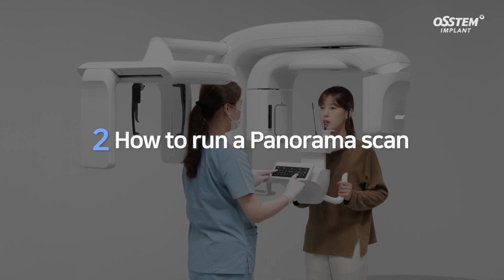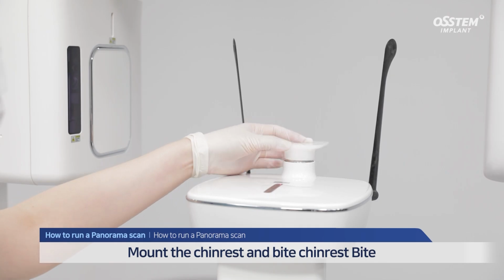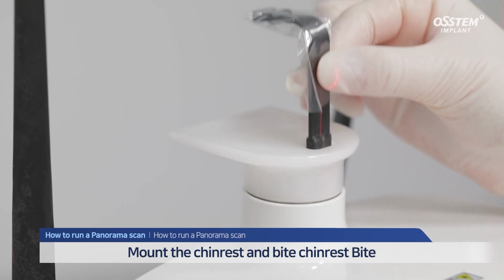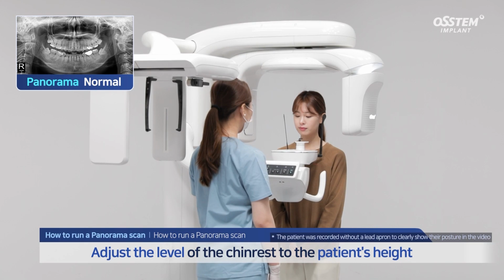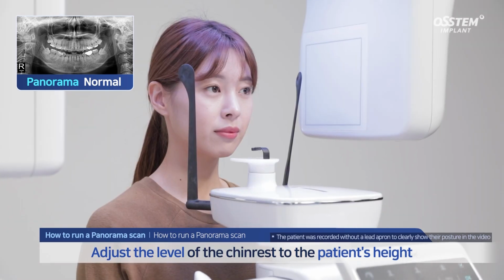Second, let's see how to run a panorama scan. Mount the chin rest and bite to start panorama scan. First, let's take a look at selecting the panorama scan mode and scanning position. Adjust the level of the chin rest to the patient's height.